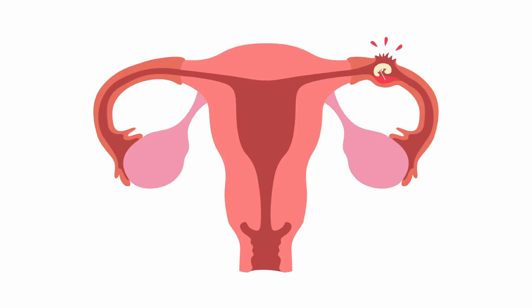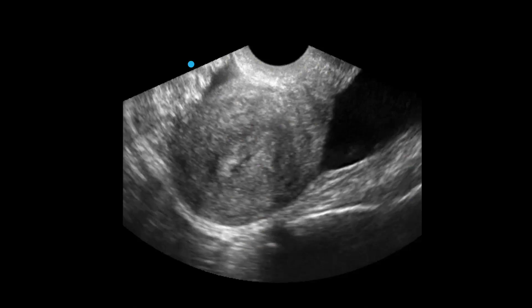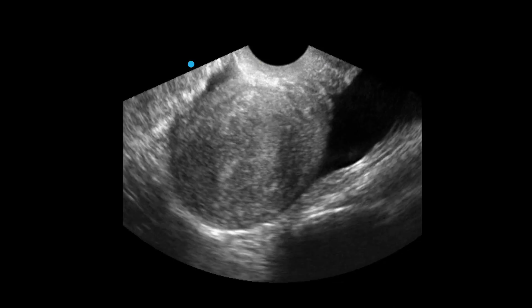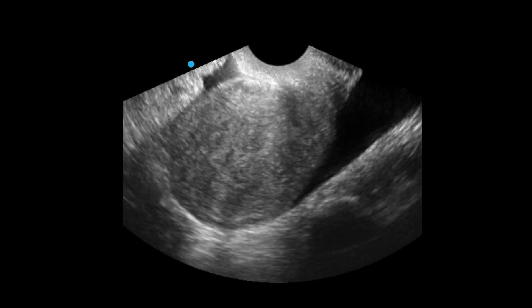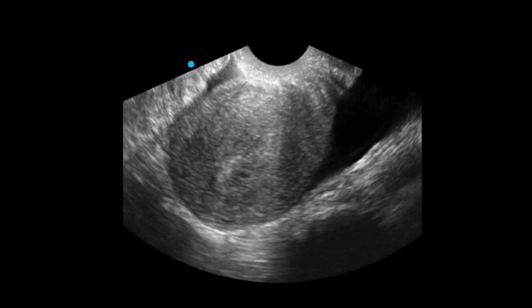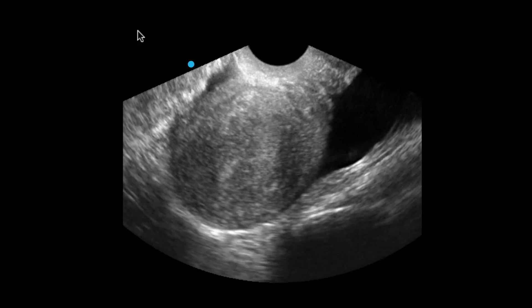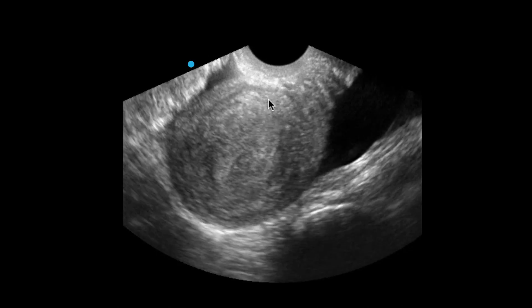Now that we've reviewed what a normal pelvic study should look like and how to definitively evaluate for an intrauterine pregnancy, let's talk about an ectopic pregnancy. When evaluating for an ectopic pregnancy, you may not always actually identify the ectopic pregnancy. You often will only see secondary signs of a ruptured ectopic pregnancy.